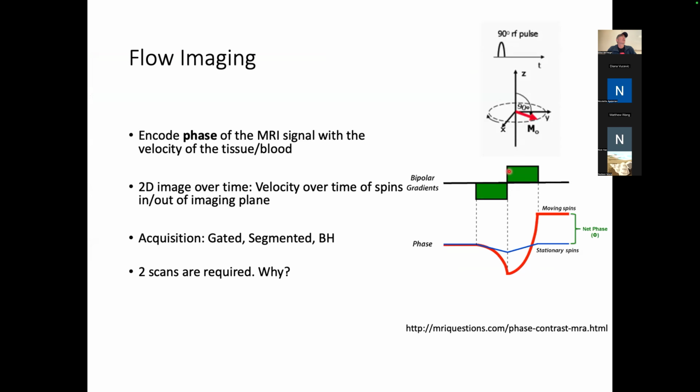Okay, so that's MR beyond, I would say, SPECT and well beyond cardiac CT, and for that matter, echo. Cardiac MRI has the ability to essentially evaluate the health of the tissue itself with many of these pulse sequences. So you can do a contrast injection, and we'll see probably in a later example, if we get there, you can also measure T1 and measure T2 and see how that tissue is doing. So if you've had a heart attack and you want to know how severe it was, what's my next move here? MRI is the way to go.